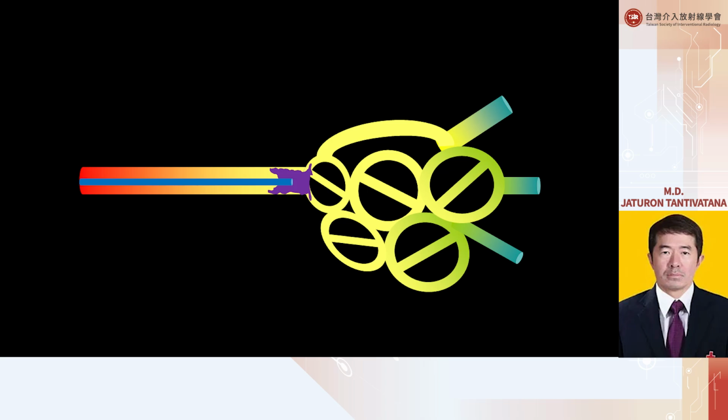Okay. This is another example of a complex AVM, which has multiple small compartments or channels inside. So this represents a high resistance model. If we inject the Onyx inside, it will face a high resistance. So first, how do we solve this problem? You have to make a plug a little bit, like a push-and-plug technique, to have some of the reflux actually encase the catheter, then build up the pressure and wait for a few seconds or few minutes to let this one harden. And then we inject again, so that we have a pushing pressure greater than the resistance pressure and can drive the Onyx through.